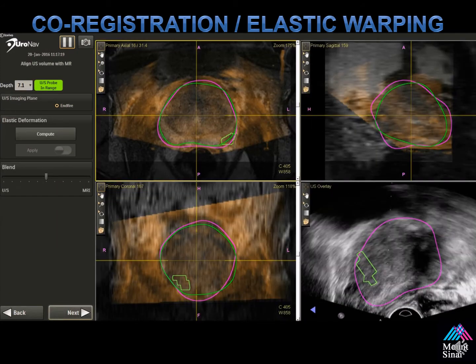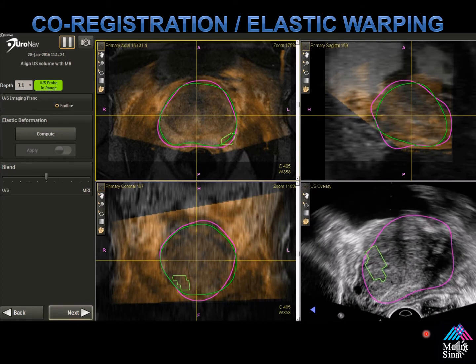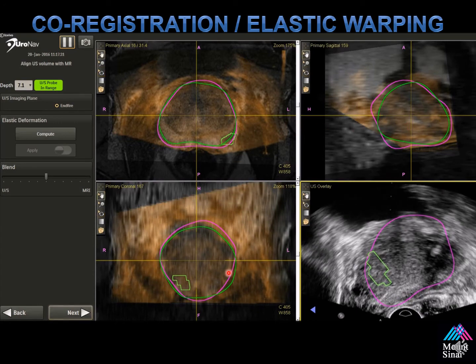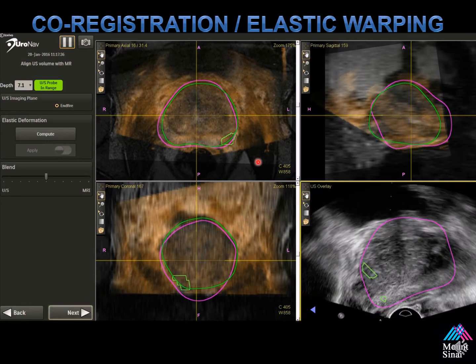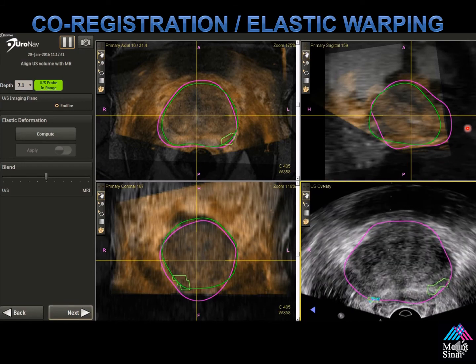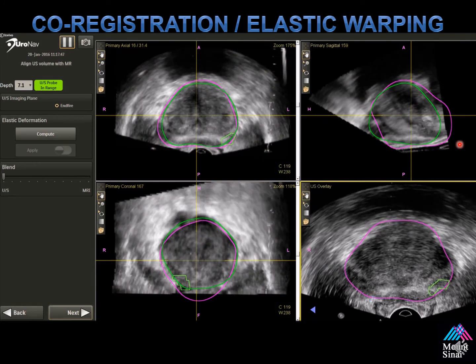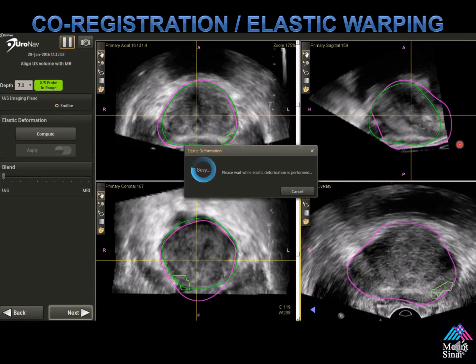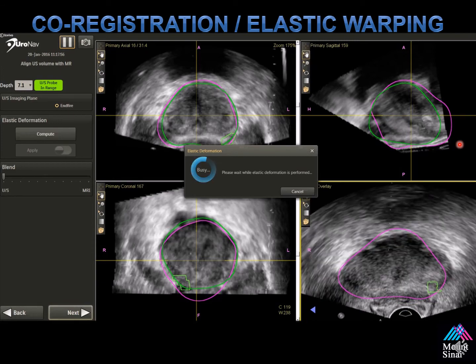This is the co-registration screen. Typically I only use this to line up the ultrasound and the MRI for my fusion. If you're going to use elastic warping, you must use these three static screens and line up the MR ultrasound fusion image to perform elastic warping. The calculation is based on how well the green and the purple lines — the ultrasound and MRI images — line up together. You can use blend to remove the MRI overlay. It's currently calculating the elastic deformation algorithm to make the ultrasound and MRI fit together.